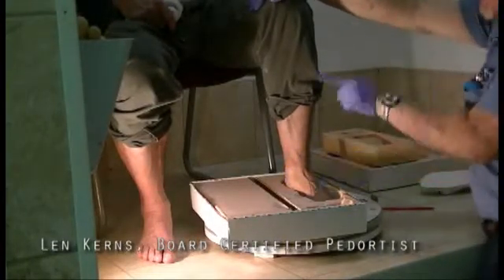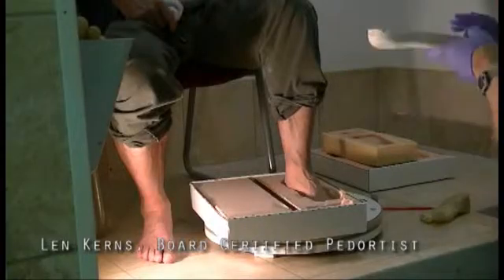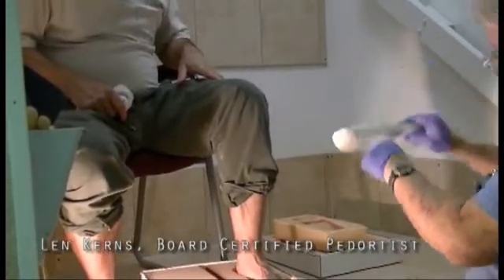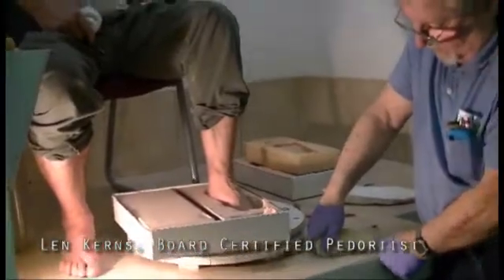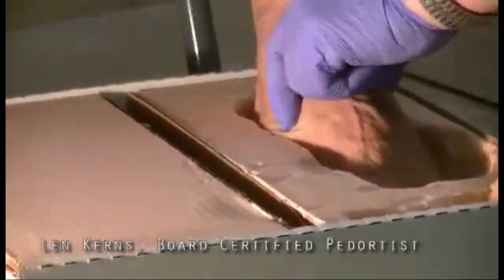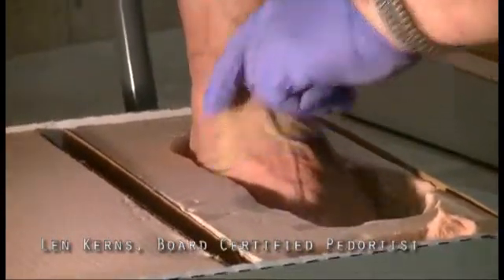Then you come back over the cuboid area, because when you have a long foot, you push the heel down and you push the fifth down, you can create too high of an arch here, which would look like it could be just 1/8 of an inch off. So you're going to come and just seat the cuboid. You don't want to push the cuboid to the floor. You just want to give it a little extra push to make sure on a large foot that it seeks its own level. And that's it.